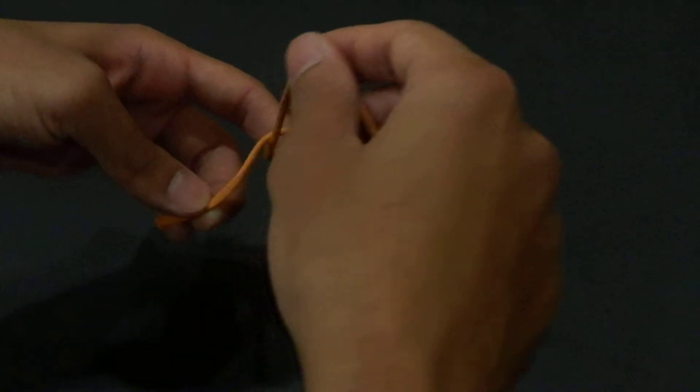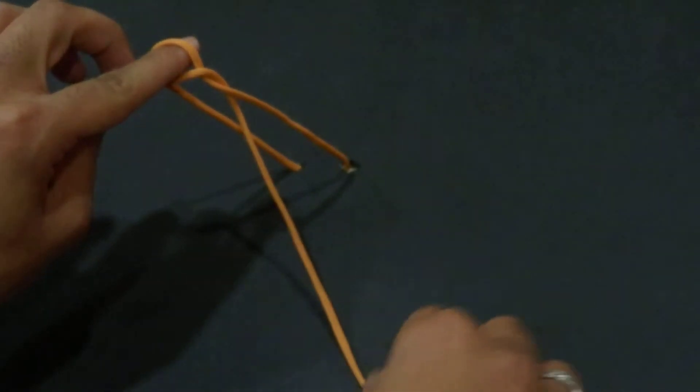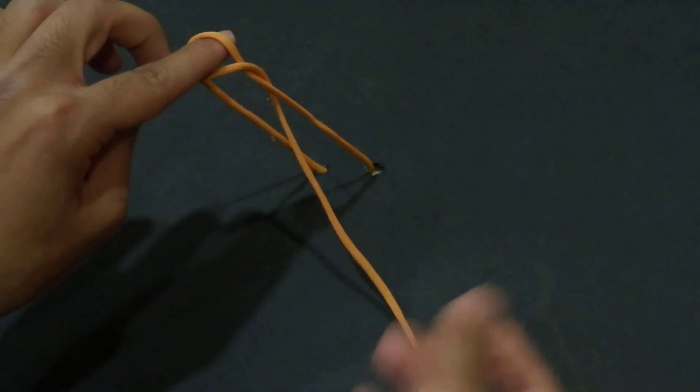Then I will tie it with the index finger, bring it behind, make the other loop and bring it inside. Here is the job of the other hand — that I will not go out, I will make the other knot by the right hand.